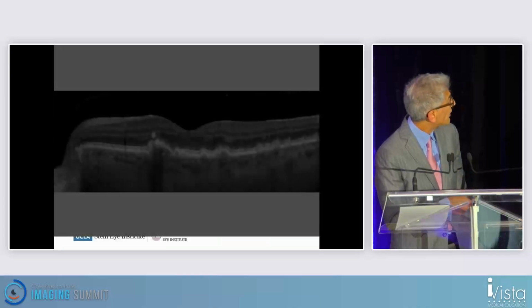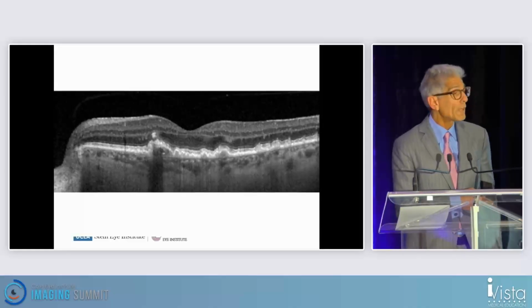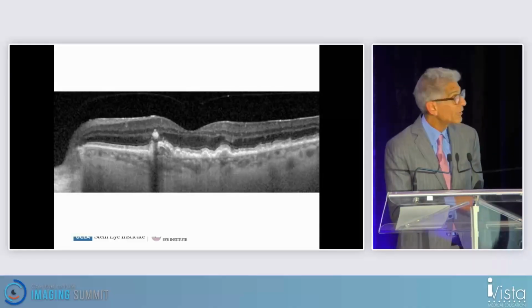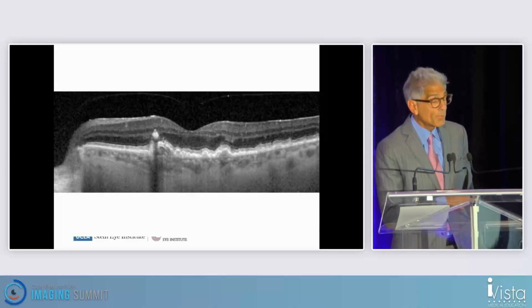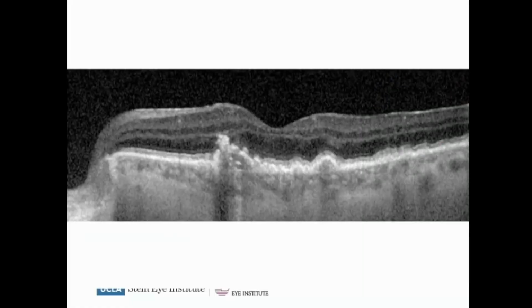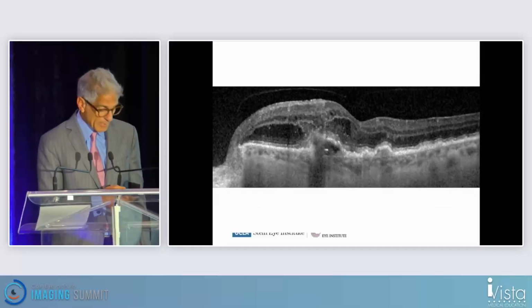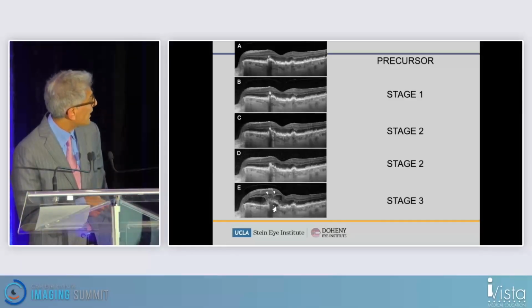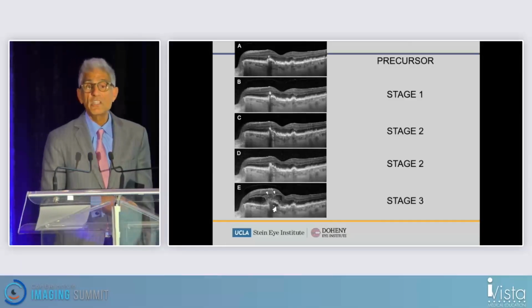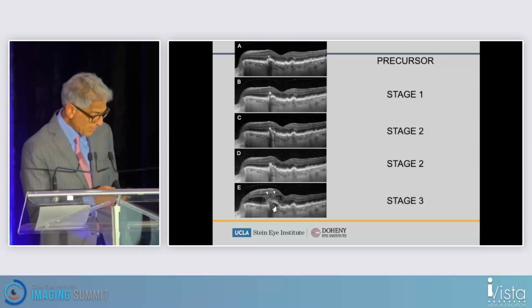And here's just a time-lapse video that shows you the evolution of these intraretinal neovascular membranes, or RAP lesions, type 3 MNV, originating in the deep plexus, growing down into the RPE, and then leaking into the sub-RPE component, and then associated with a PED and predominantly intraretinal neovascularization. And this is the still slide that shows you the evolution of that case of a RAP lesion.